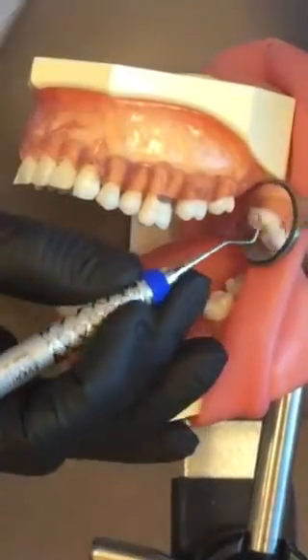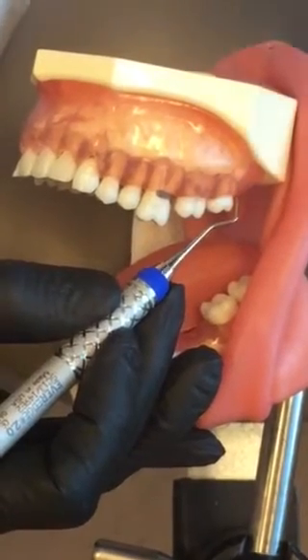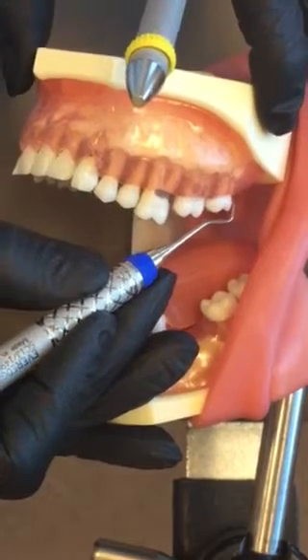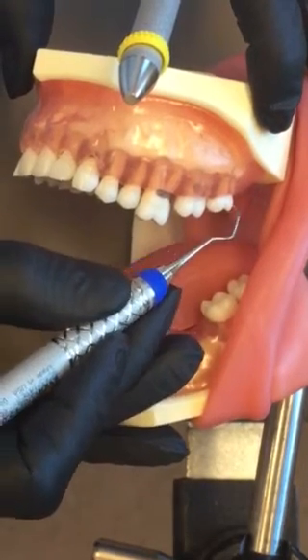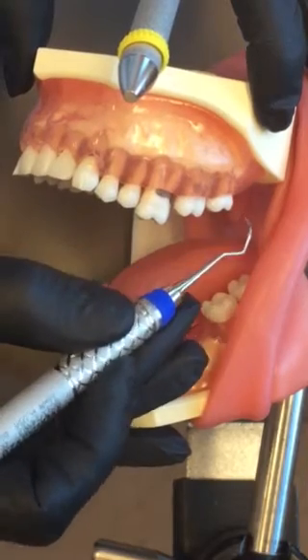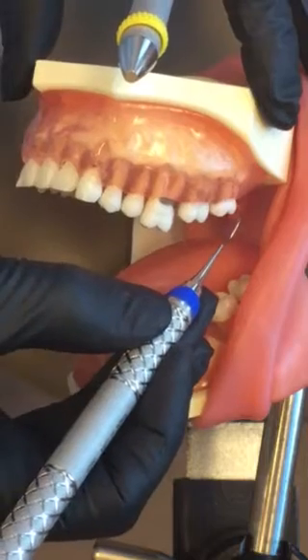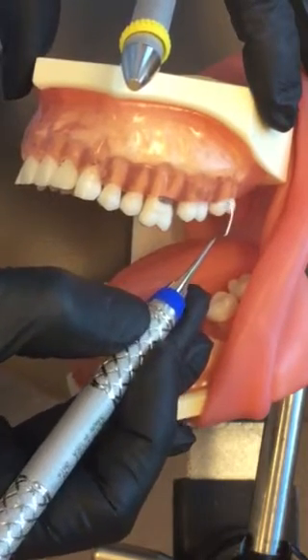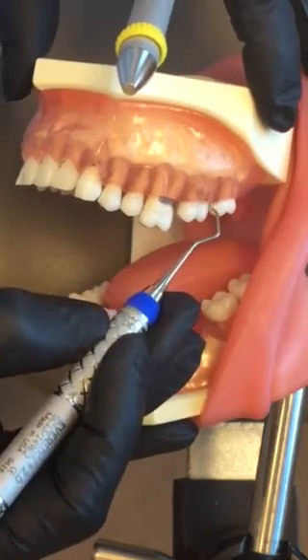You're going to start at the distal line angle. Establish a 70-degree angulation by leaning the instrument to the tooth. At the distal line angle, roll the toe around — you're going to roll the instrument leading with your toe. Start again at the distal line angle and do oblique strokes across the buccal, rolling into the mesial.